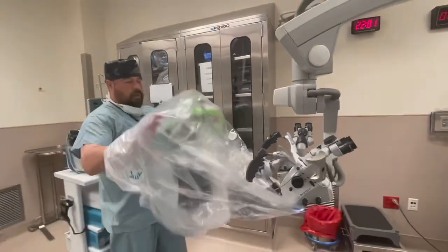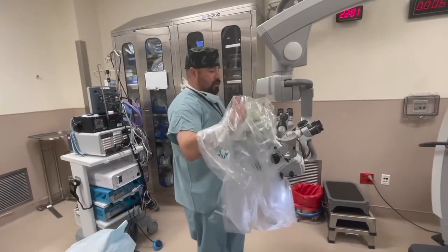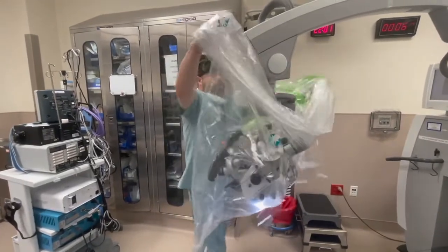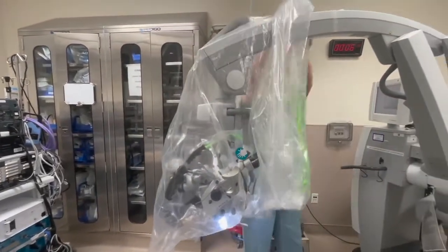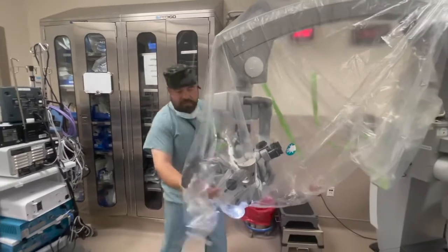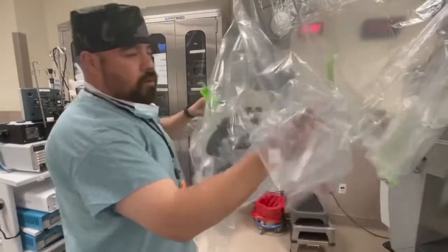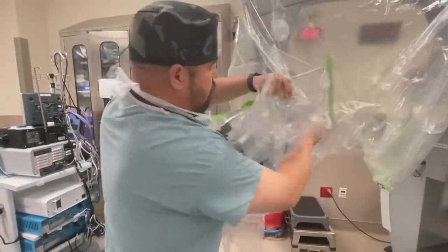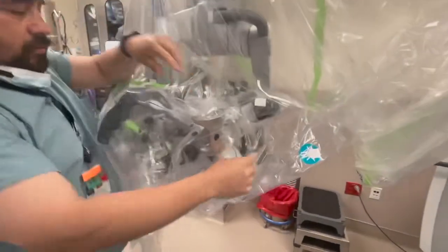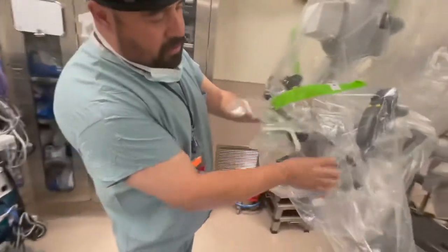Stretch out the drape a little bit, like so, and then put it over the scope. And as you can see, you're not contaminating anything because it's on the bottom. So, okay, start rolling up, and extend it all the way to the back as much as you can. Once the drape is all the way to the back, move the scope a little higher, and then you look for the attachments that go on the eyepiece. Once you figure out which attachment goes to which eyepiece, you just connect it and then you move to the one you want to work on.